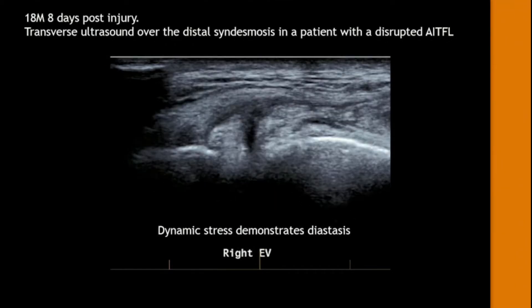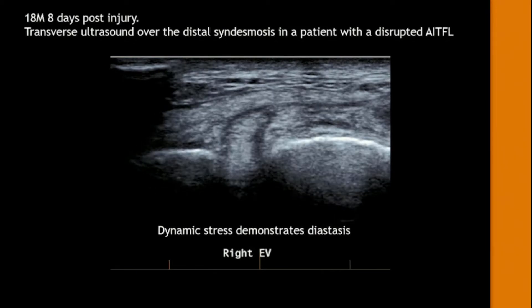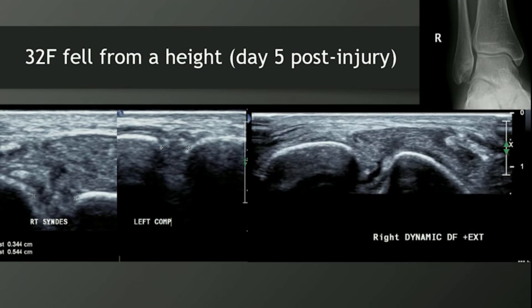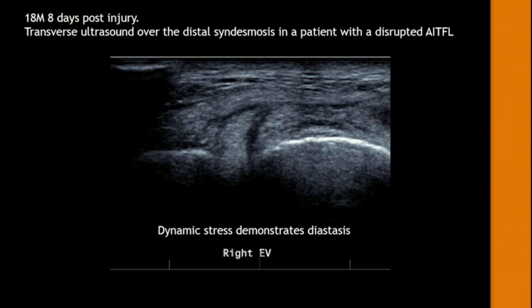Just watch the gap between the two bones. The movement's very small — it's hard to appreciate, but you can see it widening on dorsiflexion and external rotation. So this patient was 18, wanted to get on the field as quick as possible, avoided surgery, went into a boot for six weeks. We repeated the exact study six weeks later and could no longer demonstrate the widening. Some of the studies coming out of the UK are saying maybe we can avoid the tightrope repair in some patients.